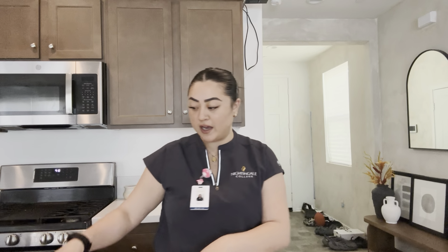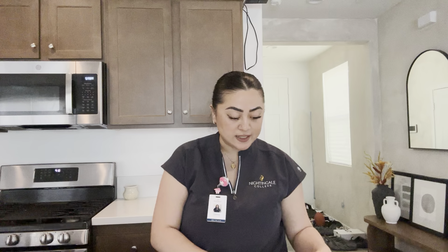Hi, my name is Chelsea, and this is the video for the IV fluid and also for the medication. I'm just going to lift everything up that I have here, all my supplies.